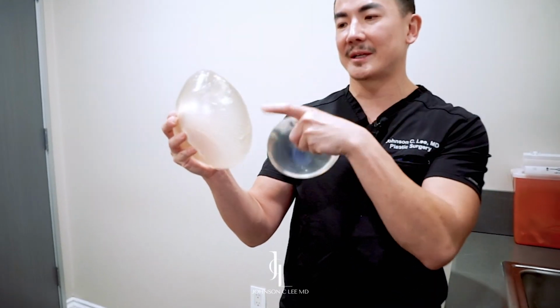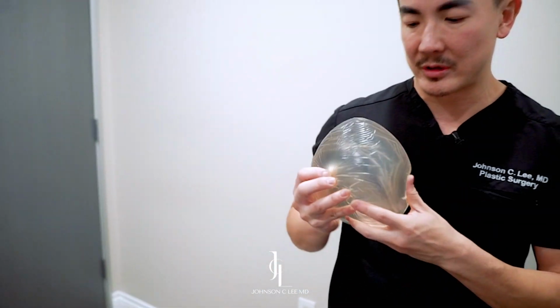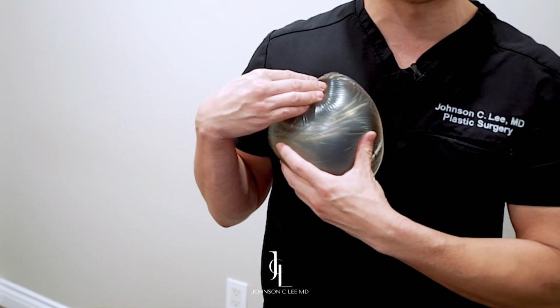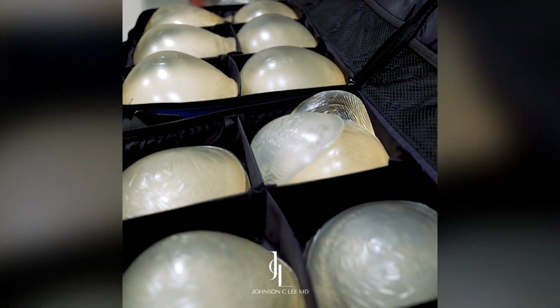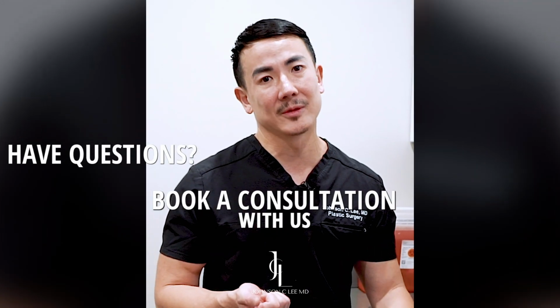A 550 sizing mold looks like this, the implant looks like this, but it translates into this in real life under your clothes. So that's why we have patients wear a sizing kit. I love using a sizing kit. Ever since these were introduced in the last 10 years, they've really been a game changer in making sure the patients know exactly what they will look like.